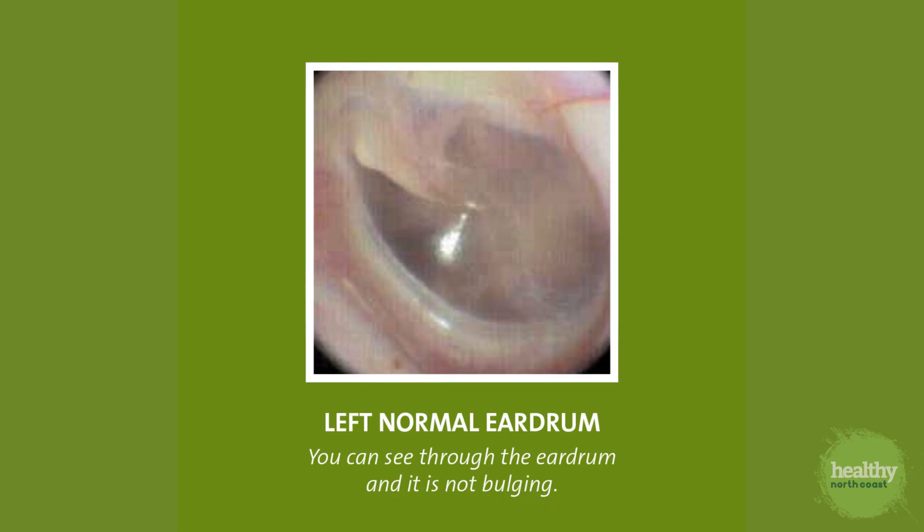Let's take a look at the anatomy of the normal eardrum using some photos we took with our video otoscope. As you can see, the most prominent feature of the eardrum is called the handle of the malleus, which is the bone that conducts sound from the eardrum to the brain.